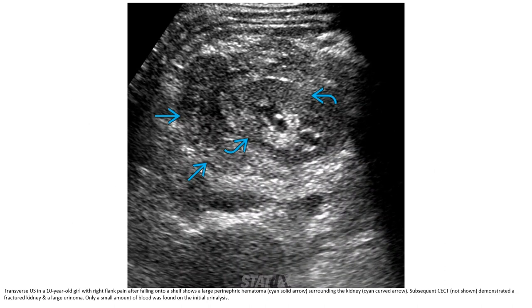This is an ultrasound in a 10-year-old with right flank pain after falling onto a shelf, showing a large perinephric hematoma surrounding the kidney. Subsequent contrast-enhanced CT demonstrated a fractured kidney and a large urinoma. Only a small amount of blood was found on initial urinalysis.